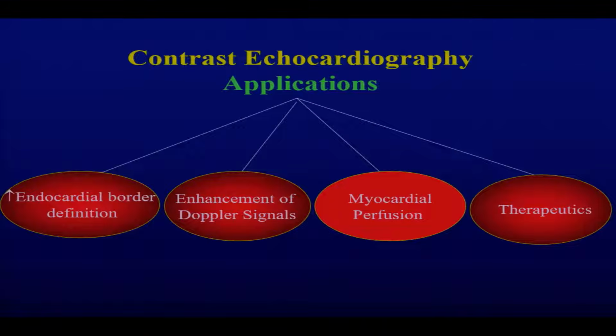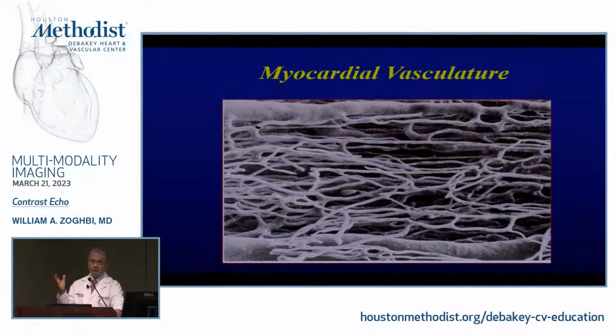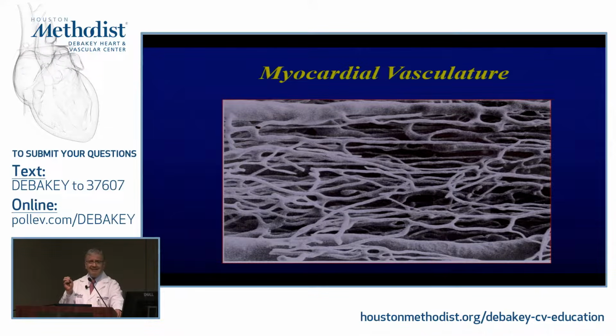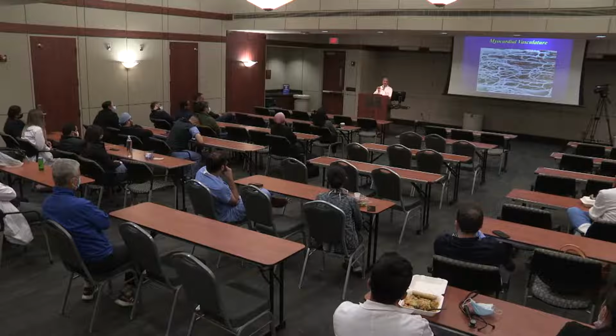All right. Myocardial perfusion, I'll just say a few words about it before we leave here. You know what the velocity is of blood within the cavity and through the valves, right? It's in cm per second. Could be 100 cm per second, could be more. Do you have an idea what the velocity of blood in the capillaries is? Dr. Talawi: In millimeters per second. Millimeters. Which tells you what?